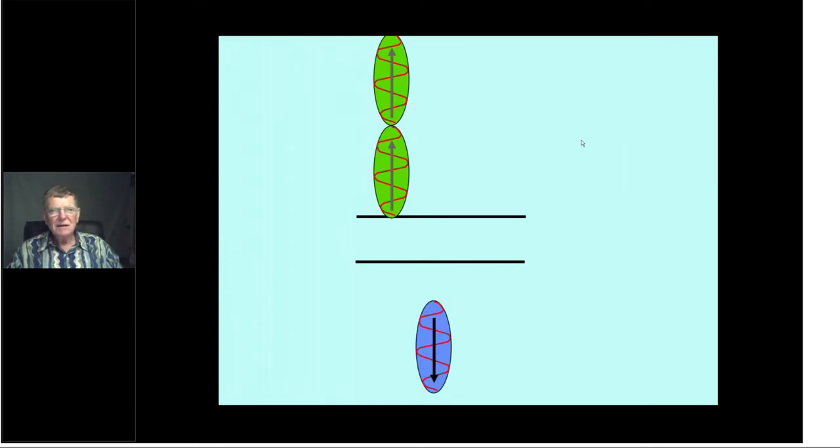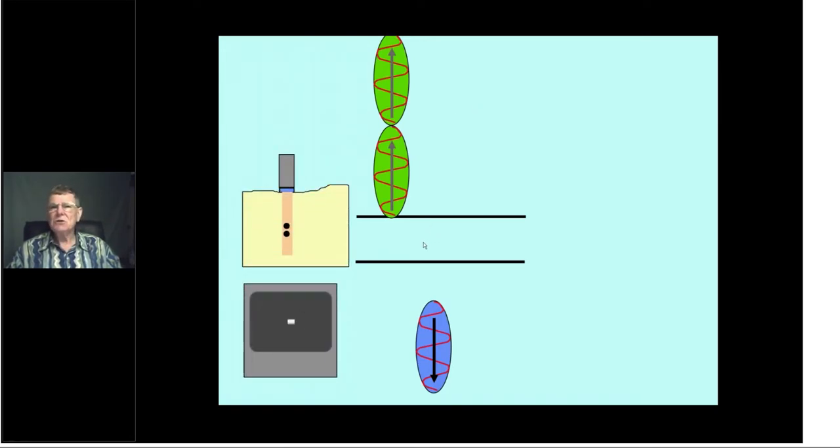And the answer, no, they're not. Look, they're touching. They will strike the transducer and the machine will detect them as a single echo. Longer echo, perhaps, but a single echo. It will not be able to discern that there are 2 separate echoes within this. So that will be seen on your screen as a single bright dot on the screen. In other words, those 2 interfaces are no longer resolved. We've lost our axial resolution.